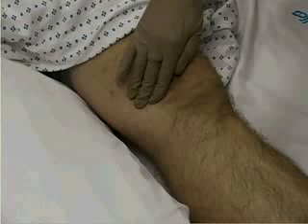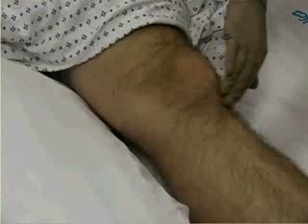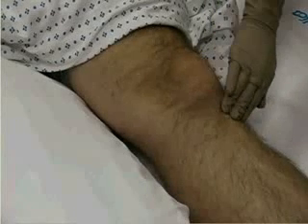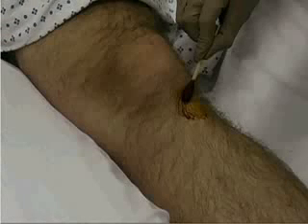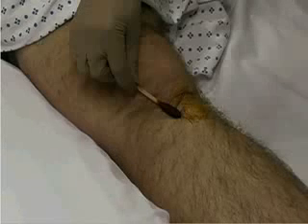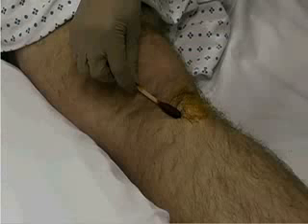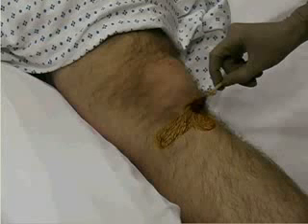Palpate the tibial tubercle, the bony prominence 2 to 3 centimeters inferior to the patella. This will be the point of needle insertion. Prep the area where the needle is to be inserted. Start at the tibial tuberosity and proceed linearly toward the tibial condyle. Repeat the prep 3 times, allowing the prep solution to dry before needle insertion.